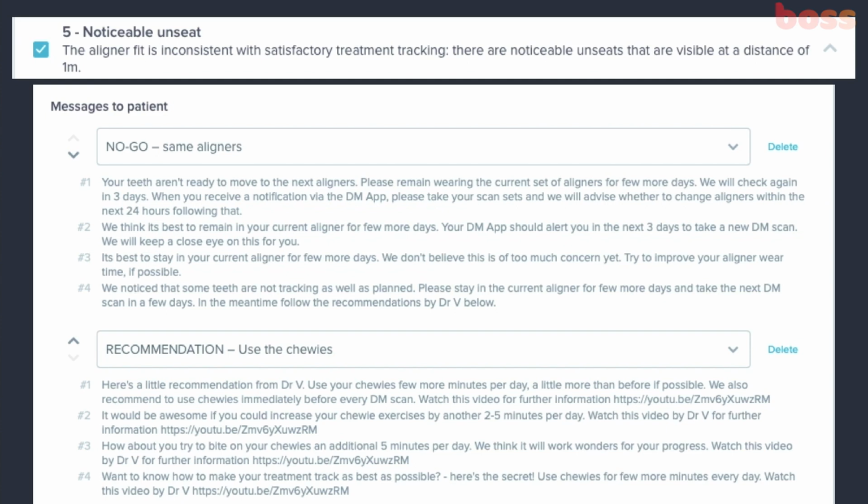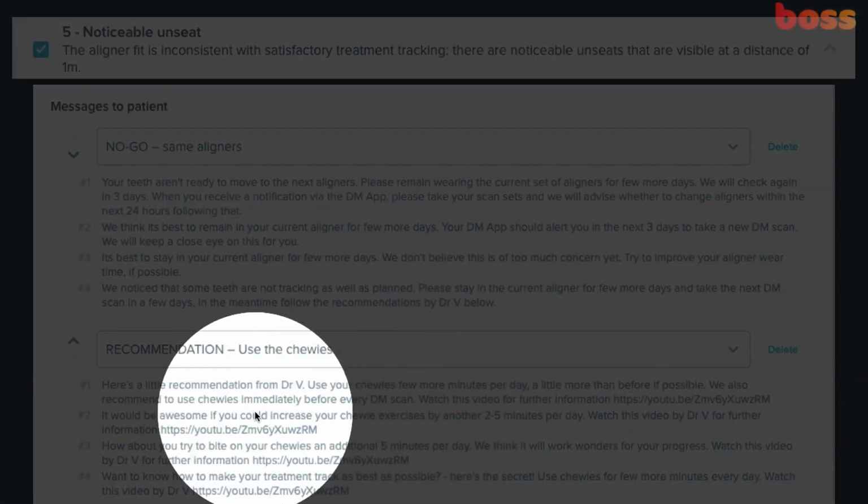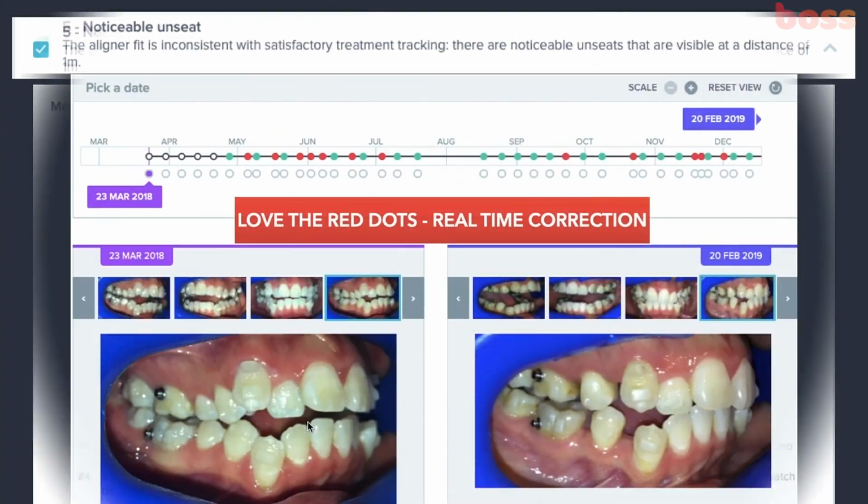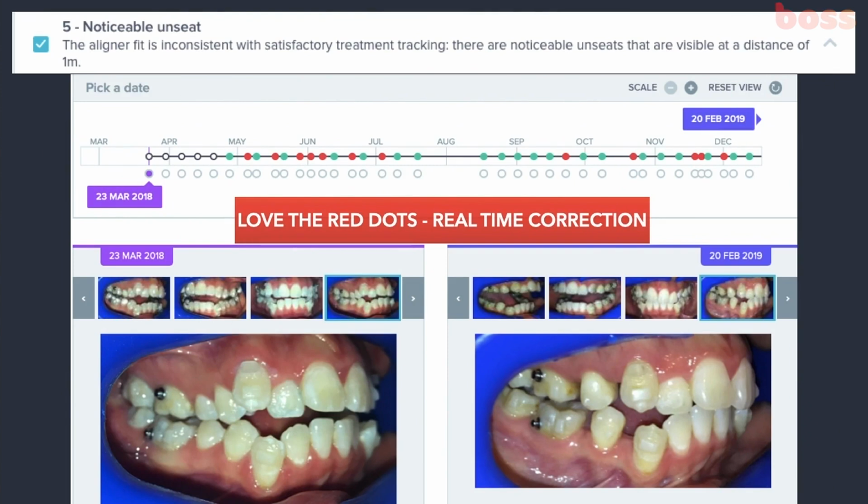done lots of chewies. Now, one thing we do, we embed YouTube videos. So we've got a YouTube video showing patients how to do chewies, right? So we're leading them to our YouTube channel. What that also means is we get increased clicks on our YouTube channel, which is better for marketing. So you can embed lots of YouTube videos from your practice channel, showing them what to do, how to brush, how to use chewies. And we do get a lot of clicks on that.